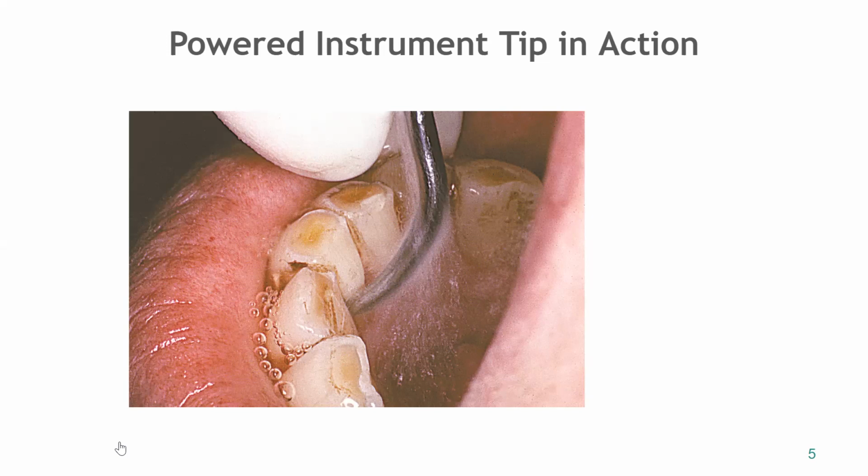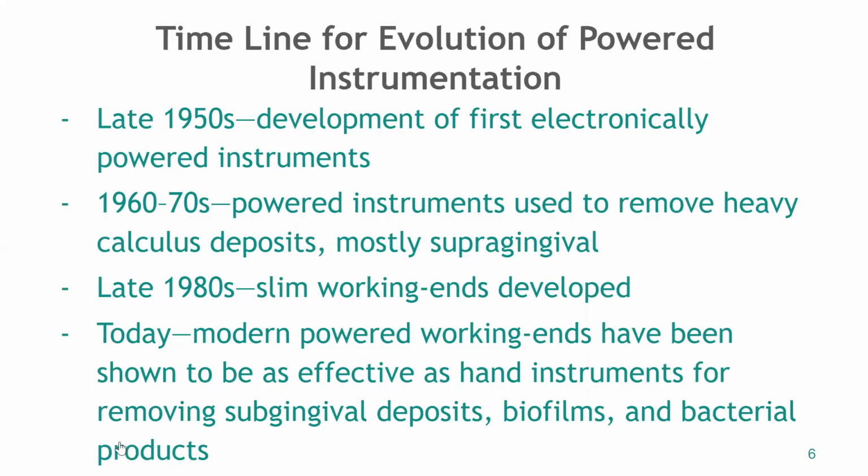I'll definitely say that in private practice, you're probably mostly going to see Cavitron units over the piezo, although I want you guys to be comfortable with both, just in case you end up in a private practice that does use only piezoelectric scalers. Okay.